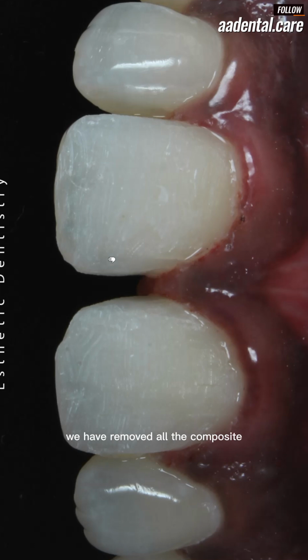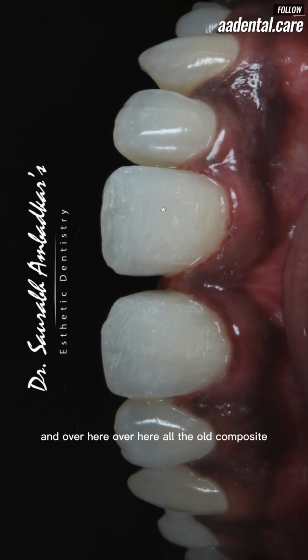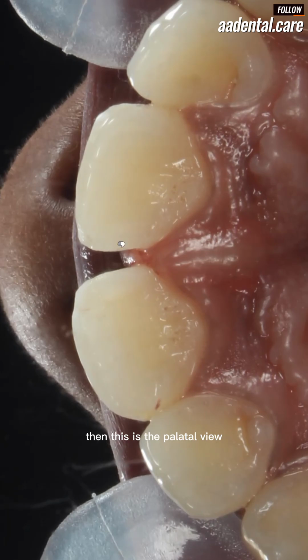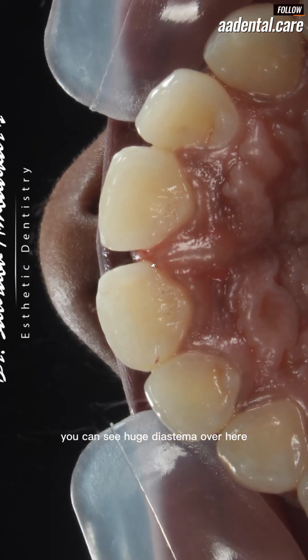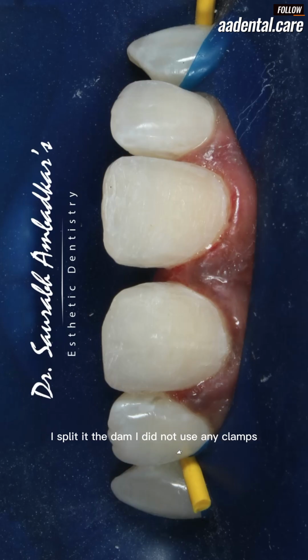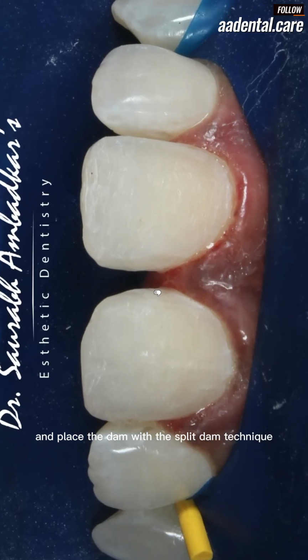Okay, look at this photograph again. We have removed all the composite. This is the original diastema now, and over here, all the old unsupported composite is removed. Then this is the palatal view. You can see a huge diastema over here. After this, I decided to go with the split dam technique. I split the dam. I did not use any clamps. I just used wedges and placed the dam with the split dam technique.